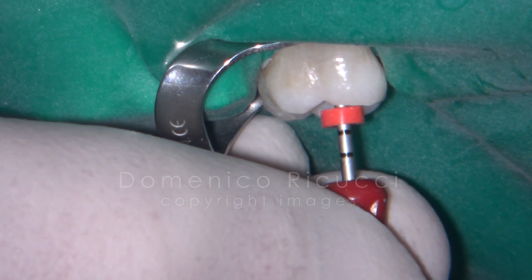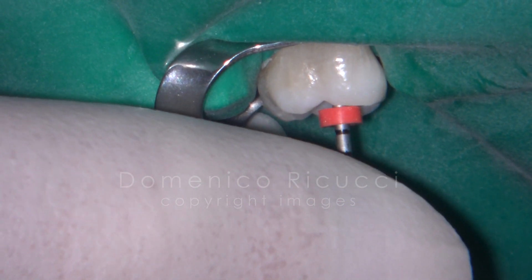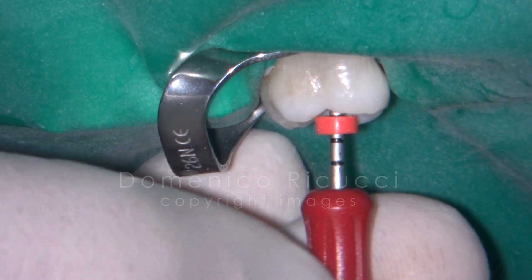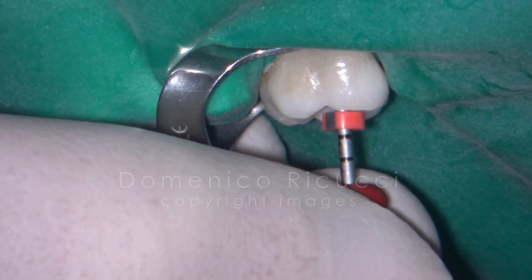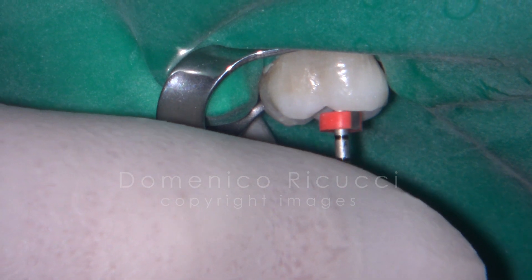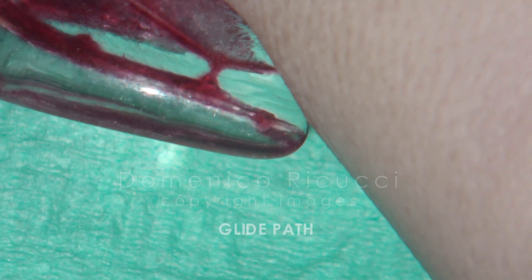Important: I have no preference for any nickel-titanium instrument. All of them are round and have the same limitations. The following is just an example of protocol.